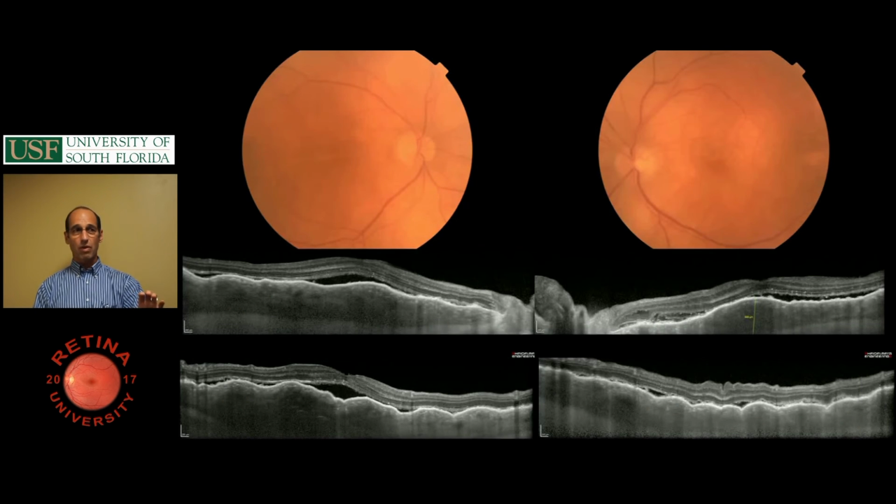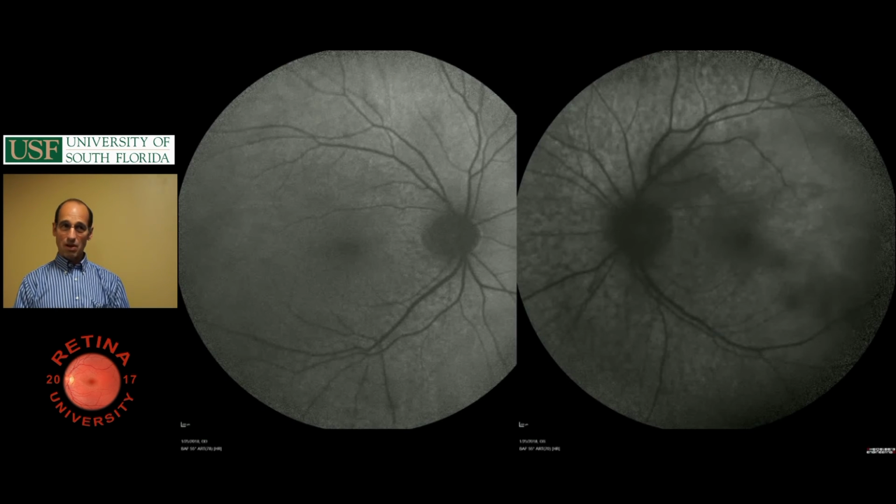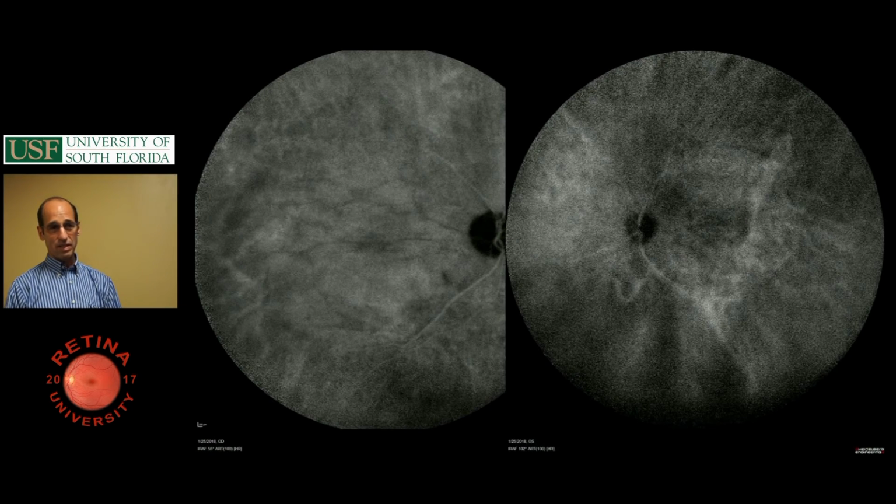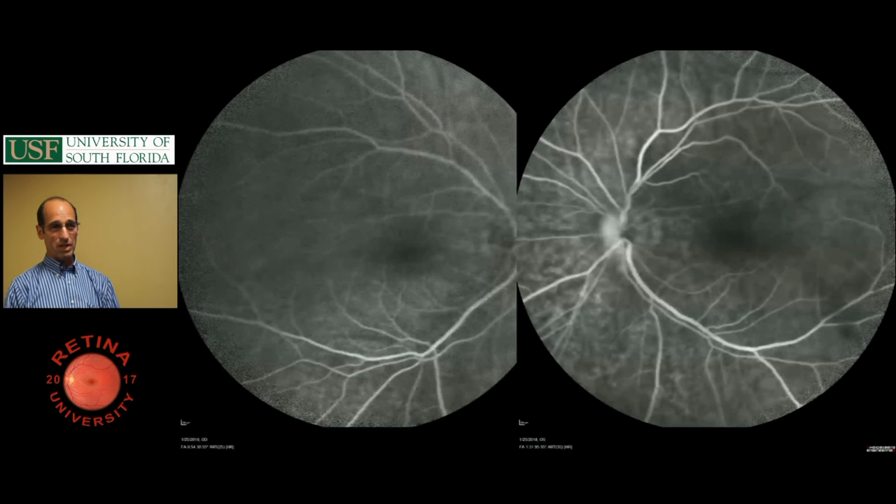We've seen a bunch of choroidal images today. This looks more infiltrated in both eyes, and you can see the undulation. You can see the choroidal folds because there's not much room there. Things are being shrunk in. This is the autofluorescence, which doesn't really show you that much, and this is the fluorescein, which is a little tough, and then the ICG also doesn't really show that much. Fluorescein showed you something. Yeah, it shows sort of a leopardy hyperfluorescence.